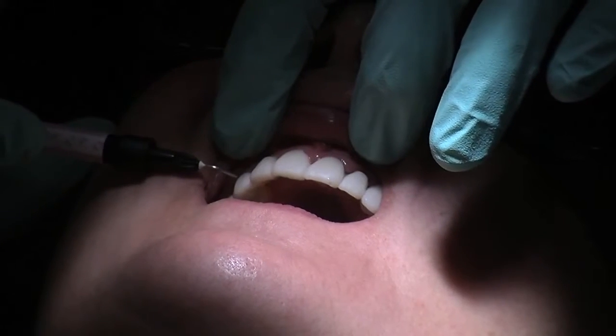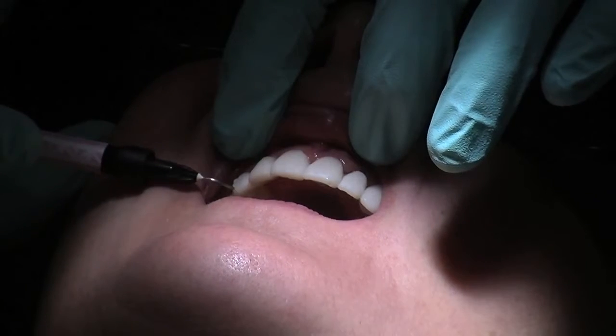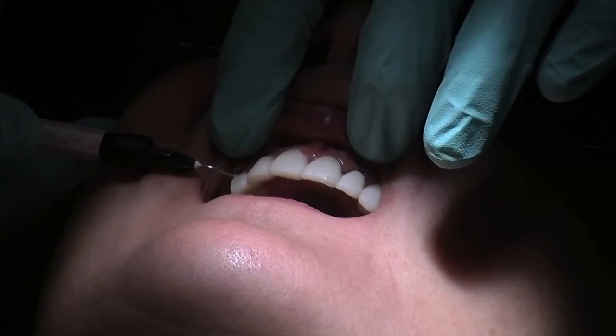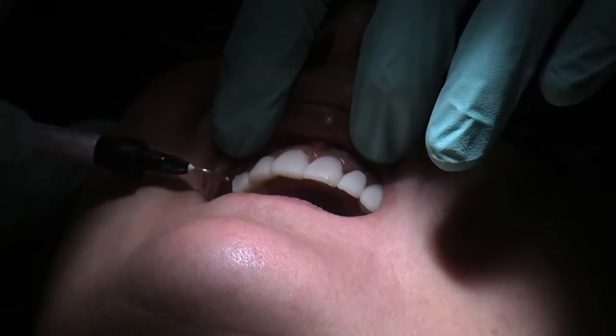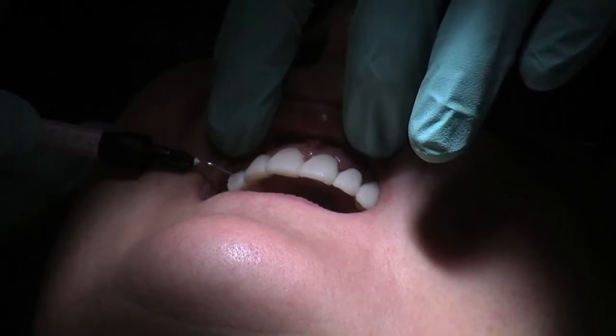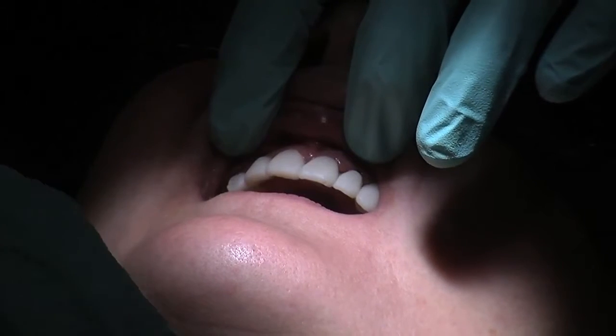So another thing I can do is just add a little bit of Luxaflow here on this upper right canine, because it's actually slanting in slightly too much. I just want to improve the labial contour, bring it out slightly more bulbous. So I'm going to add a little bit in the mid position of the tooth, making almost like a little ridge. Have the light please here.